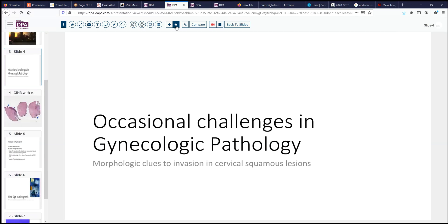Our case today again comes from the occasional challenges in gynecologic pathology, and we want to focus on cervical squamous lesions. In this case, a patient who had an abnormal pap smear and underwent a LEEP cone biopsy. The reason we do that is to evaluate for evidence of something worse than what was seen on a pap test — to identify invasion. Our focus today is on what things to look for when we are trying to decide if there is an early invasive carcinoma present.